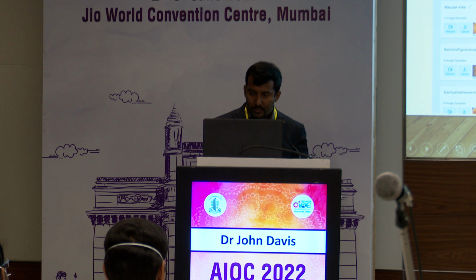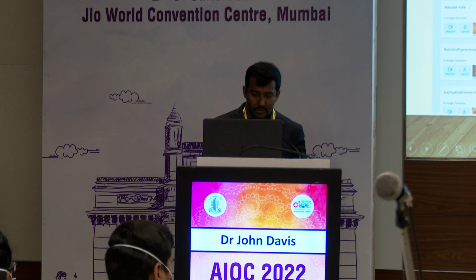And the most common use of AI in ophthalmology is fundus images to detect diabetic retinopathy, and the FDA has approved IDx-DR for this purpose, for detecting referable DR. And typically it requires more computer processing power, so it is uploaded online to a server, which is not always possible in places like India, and in large scale screening in rural areas where it is most needed. There was a study which showed an offline AI by Medios AI, which is on the Remidio Fundus on Phone from Bangalore, which showed a high sensitivity and specificity for using this. Teachable Machine allowed the creation of a simple AI at actually zero cost.